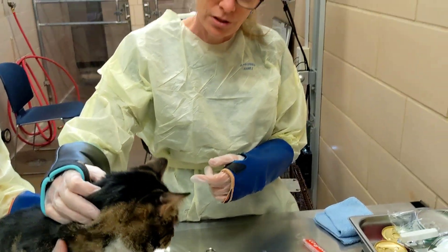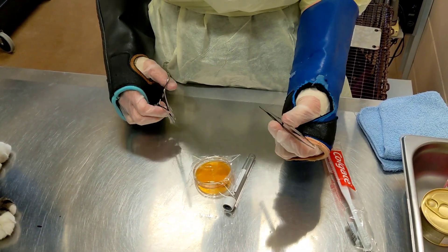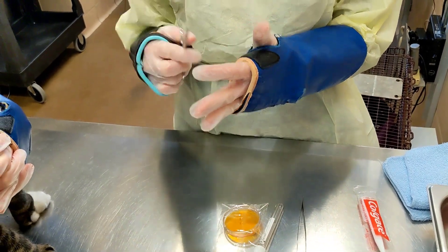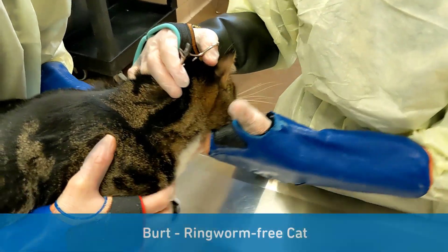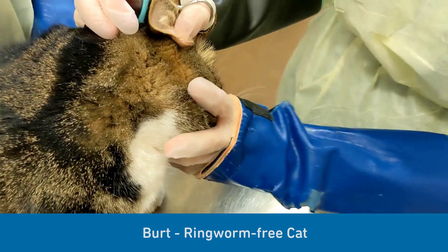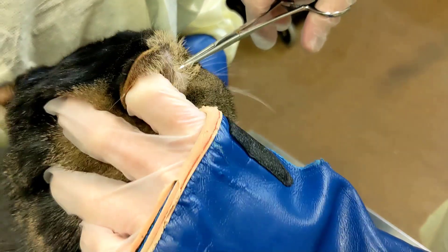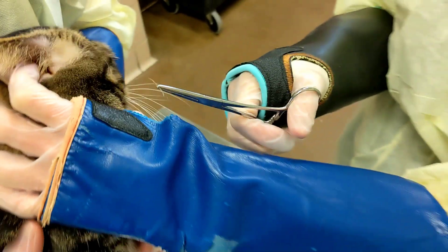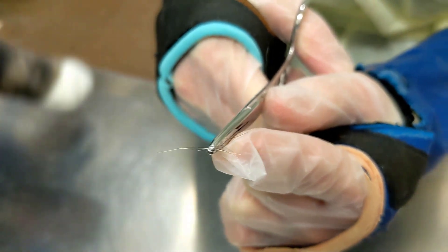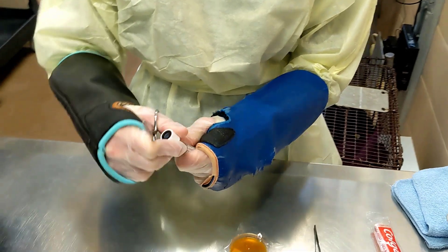Ideally you want to start with the plucking first. You're going to take a hemostat — you can also take forceps, however you'll get a little less surface area. I like the hemostats because you can get a little more fur. This animal doesn't have a ringworm lesion but we'll pretend he has a lesion in this area. You would go right around the edges of the lesion, put your hemostat as far down to the skin as possible, and pluck out some fur. You want to get that root base. You want 10 to 20 pieces of fur with potential root bases, so we may need to do another pluck — we're going to put this in a sterile white top tube.